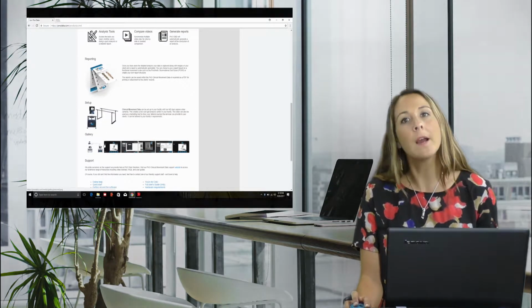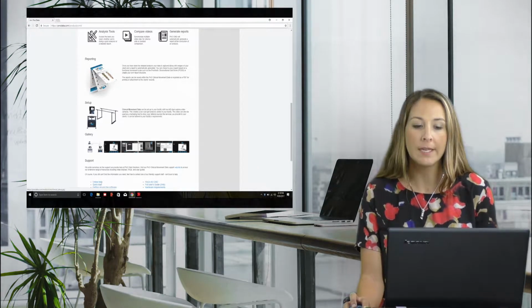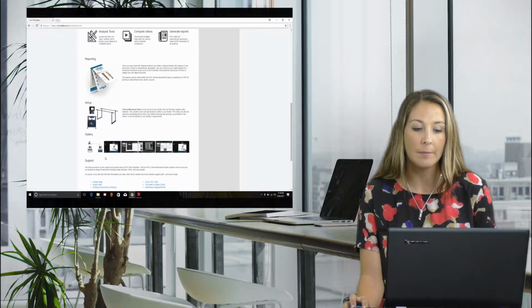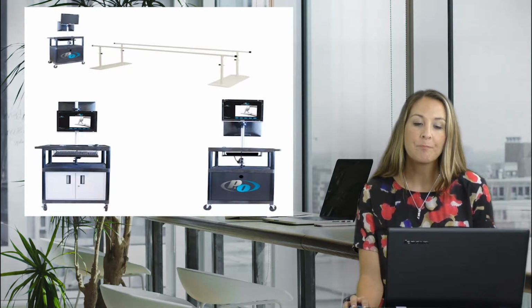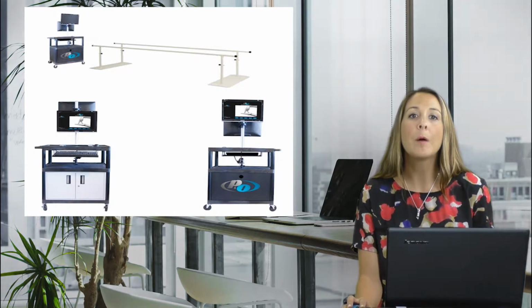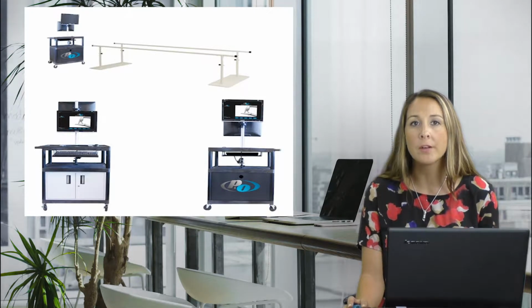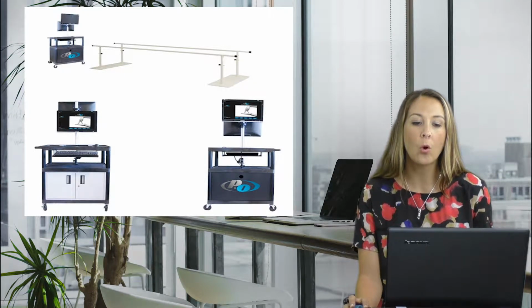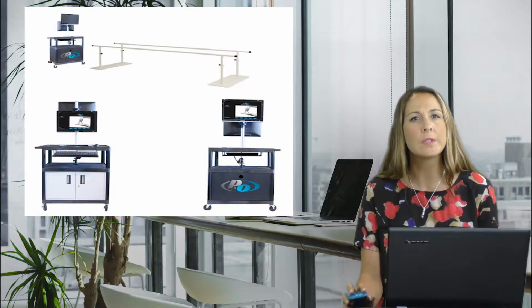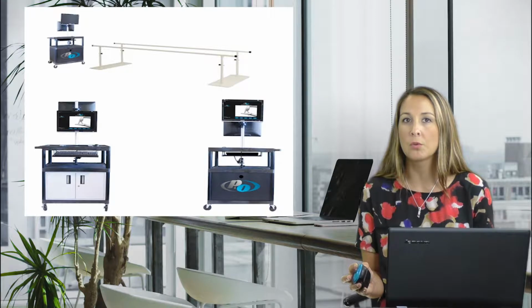So we provide software at PnO Data, but we can help you to get a video motion analysis lab started in your facility. So this image here is going to show you how we can help you to order all of the equipment, being 2 different monitors, 2 different cameras, a whole cart that allows you to really create a nice patient-centered approach to two-dimensional motion analysis.